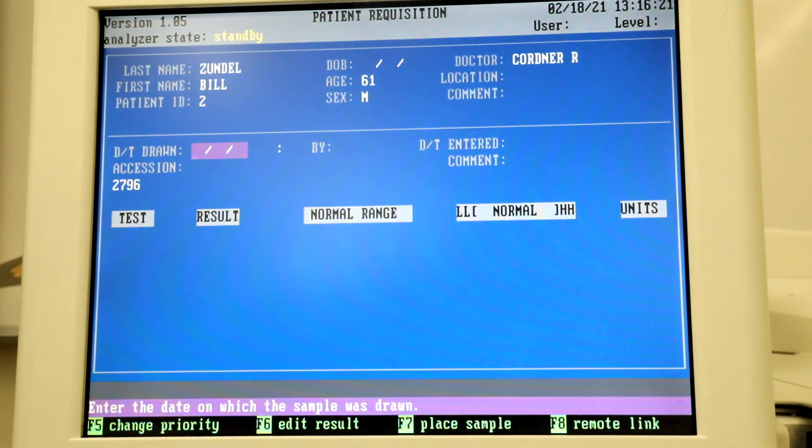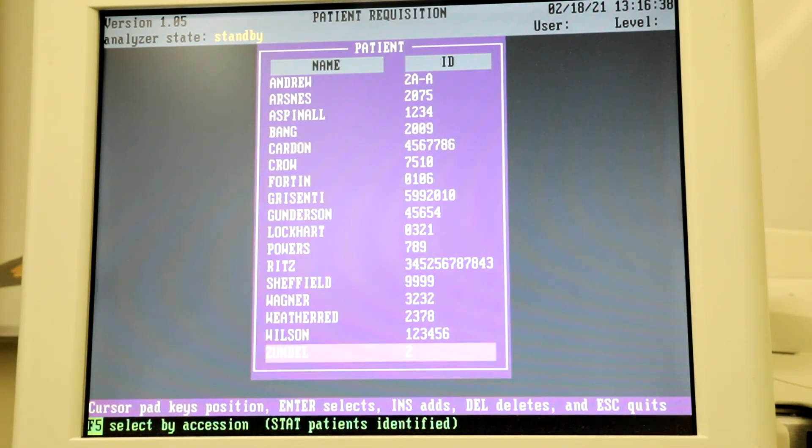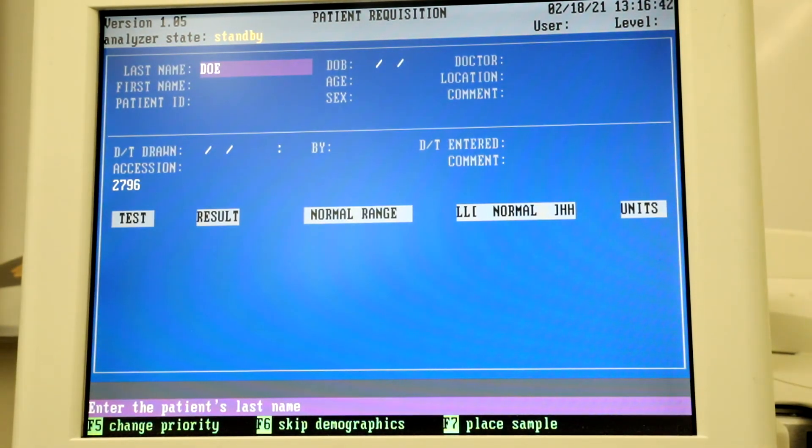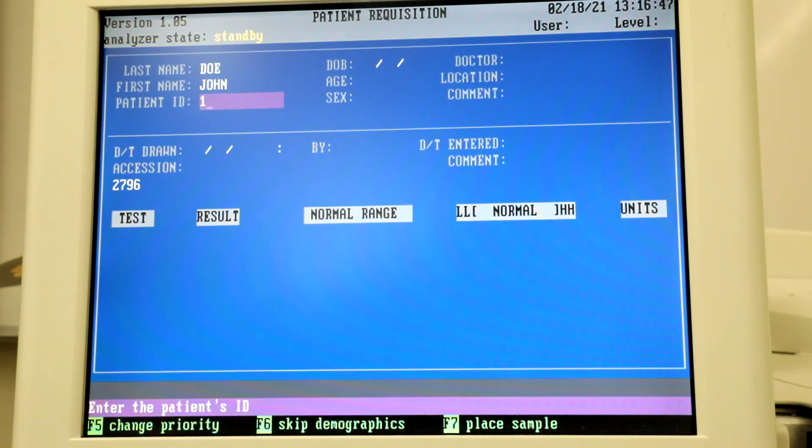If you need to be added in as a patient, select INS. Enter in your last name, first name, and patient ID.